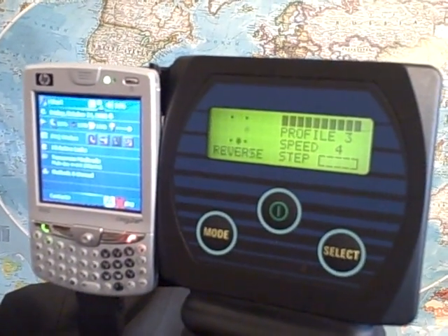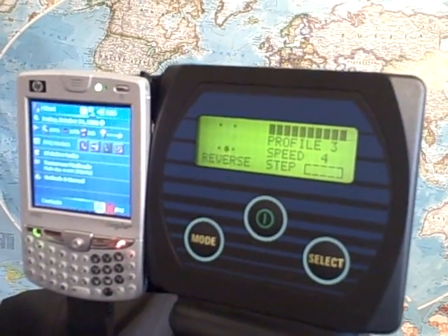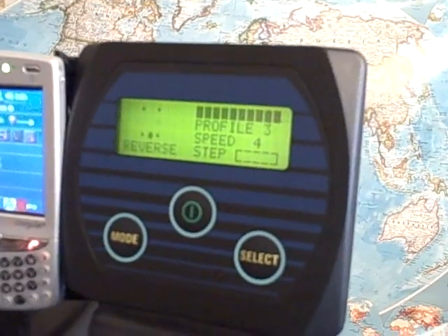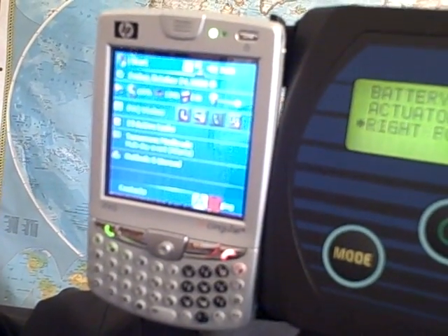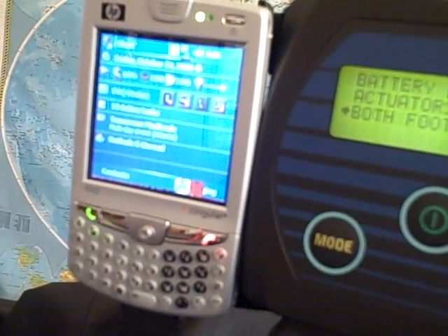Tinkertron's Dual D-Box offers two switch outputs from the same EMG sensor. This allows Mr. Gabbard to control both his power wheelchair and his pocket PC phone from a single EMG sensor on his left pectoral muscle.